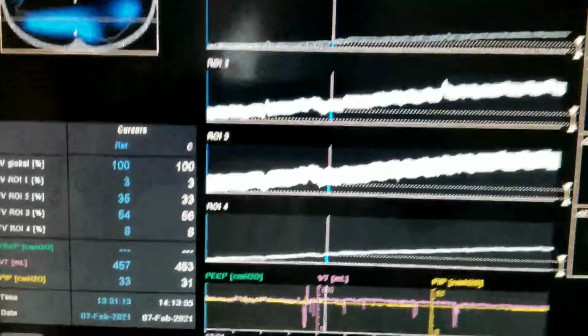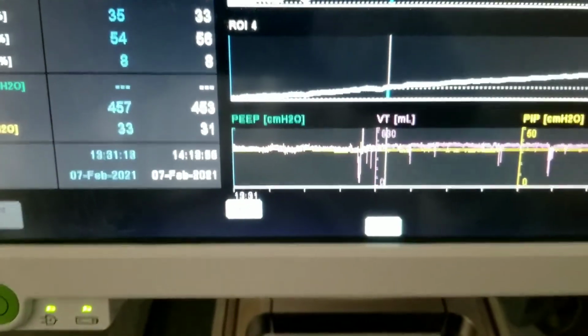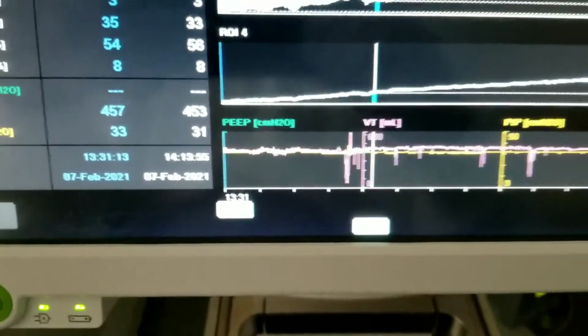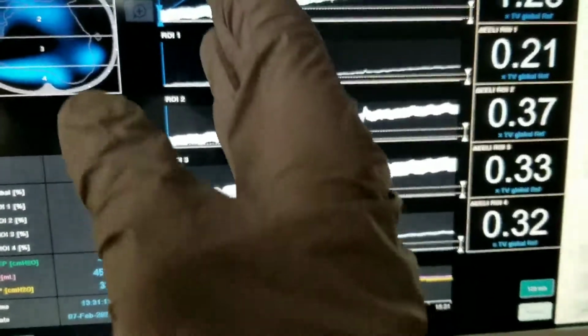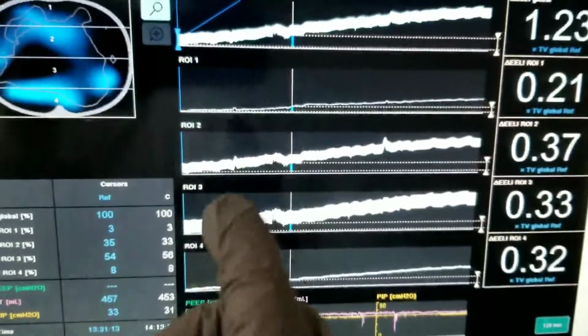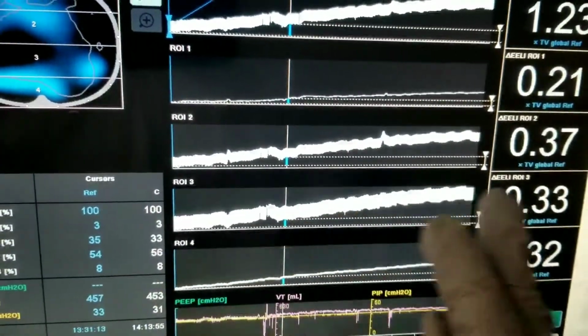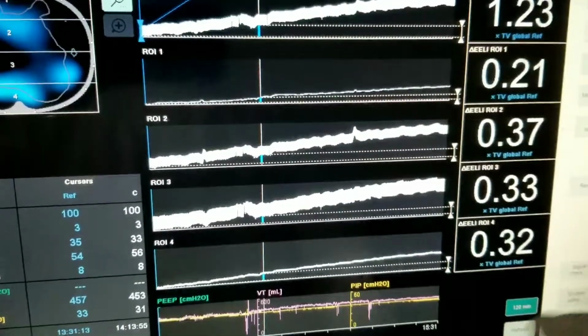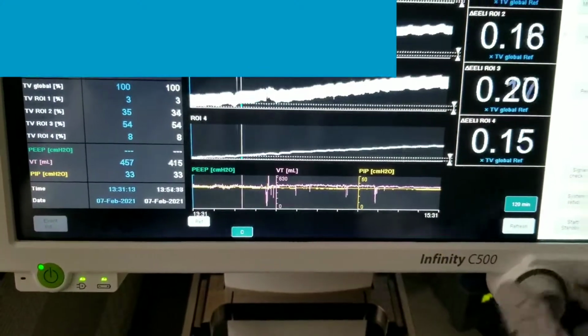Okay, now the previous reference that I had put was when I had 32 and I went to 31. So the reference was looking at what happened when I dropped from 32 to 31. I saw such a great result, so now I pressed 31 as a reference, and I'm going to see if that 31 is continuing to have improvements. So sorry for the wiggling. Let's bring that over here.